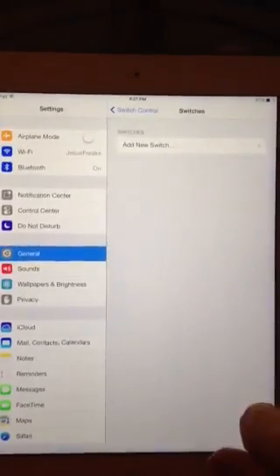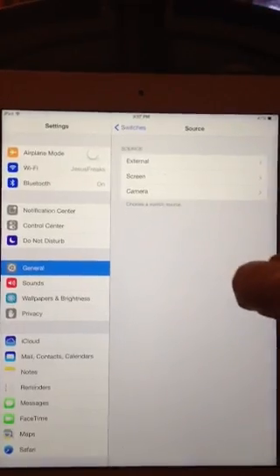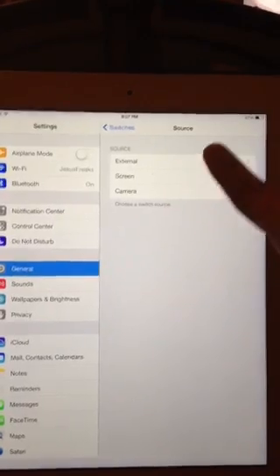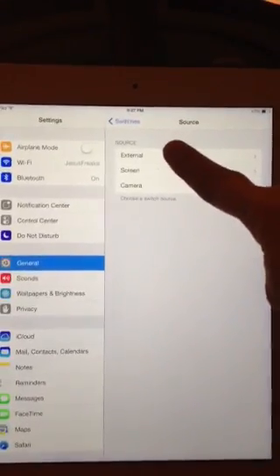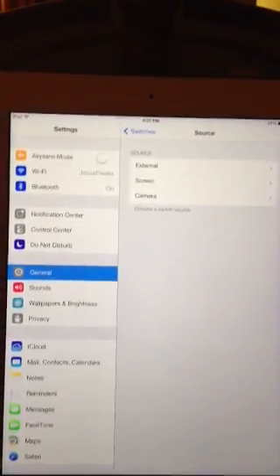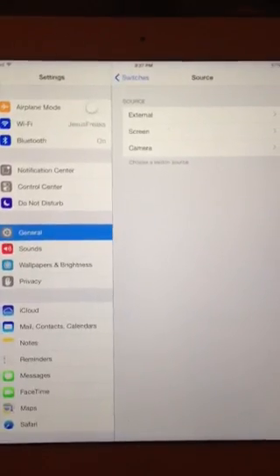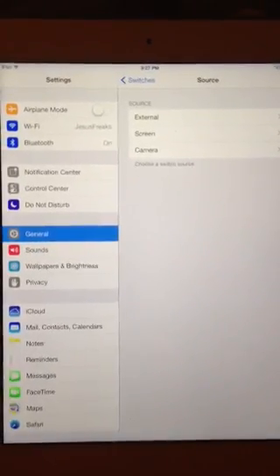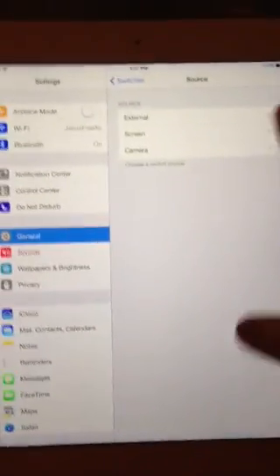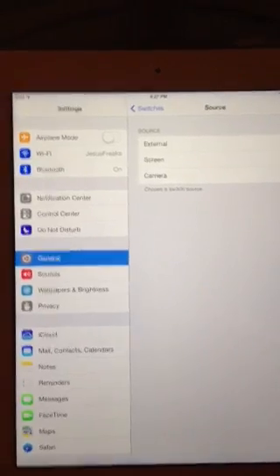Before you turn Switch Control on — because it'll start scanning — we're going to set up a switch. We're going to add a new switch and then use the camera as our switch source. You can also choose External, which would be like a Bluetooth device, and you could even program your iPhone to work as an external switch for your iPad. You can also use your screen, which will allow you to touch or double tap.